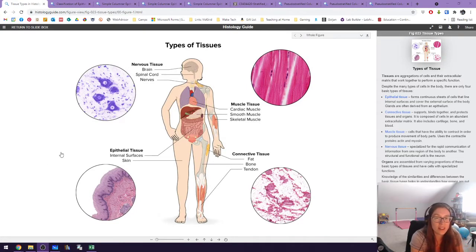All right, we're going to continue our histology slides. Once again, we're returning to the epithelial tissues. Remember, epithelial tissues line surfaces or cavities or cover the body, like the surface of the skin. Usually for an epithelial slide, you'll see an area of white on the slide, next to the free edge, or you might see a lumen on the inside. The tissue right next to that white space is the epithelial tissue we're looking at.